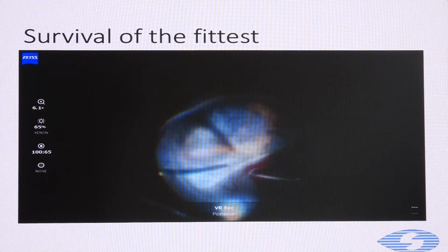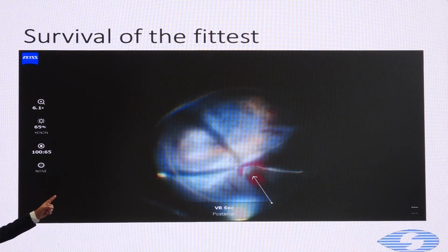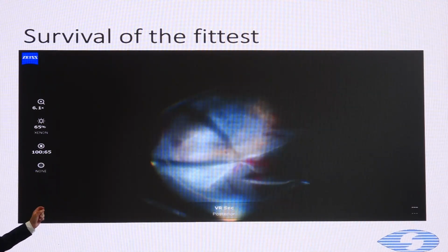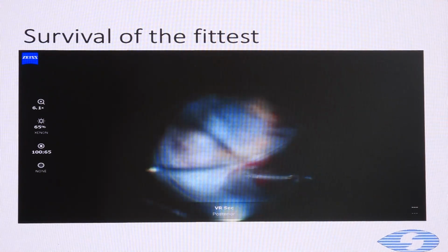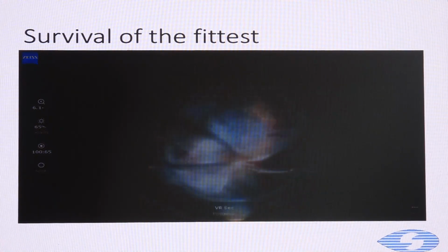Now this is one step which could be a very interesting point. If you see that thick layer, it seems like that's the area of entry, but actually the area of entry is that very thin whitish membrane which is there. I don't know, at least in my hands, I would never be able to get in the unimanual way. I think bimanual gives you that plane of dissection.